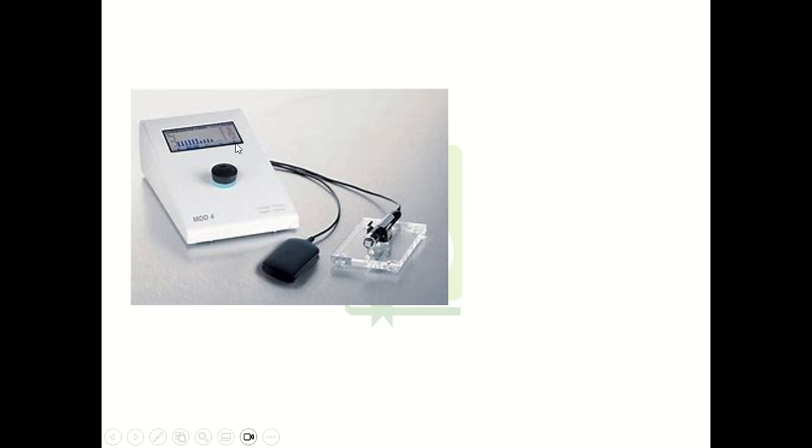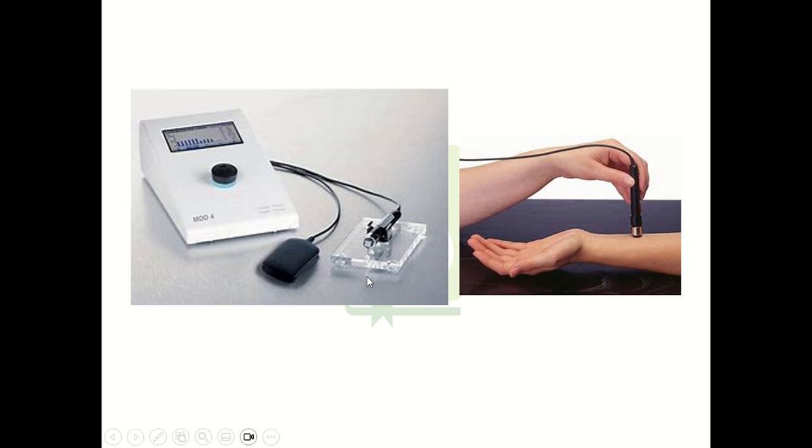On that display unit, the measurement of hydration of your skin will be given in units. These units range from 0 to 120. 0 tells you that your skin is extremely dry, and as the value approaches 120, it tells you that your skin is very well hydrated. Now you can see here, this is the probe. This probe is kept on the skin whose hydration level is to be determined.